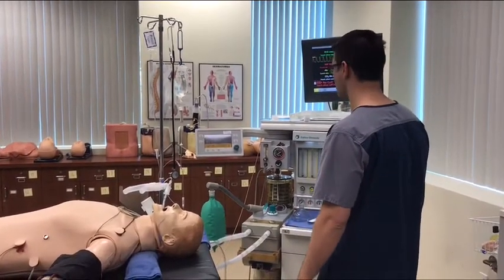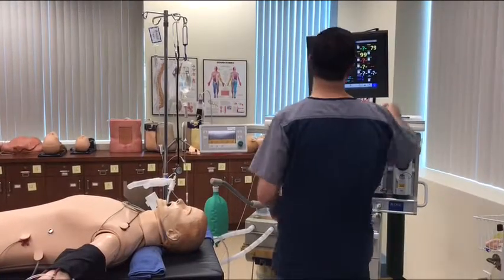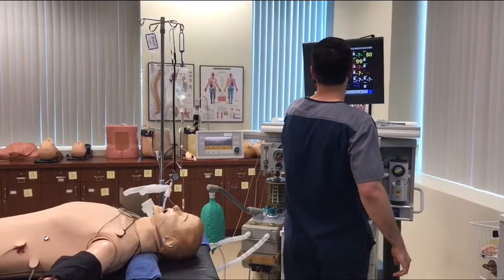Are you ready? Yeah. So the patient is in maintenance. Okay. What does your EKG look like? I need my stuff actually. Manual.